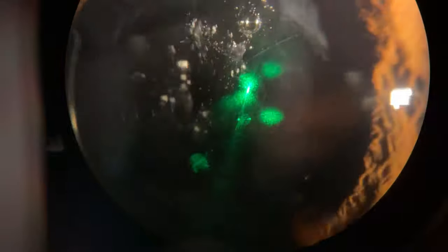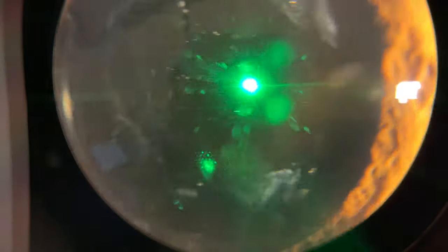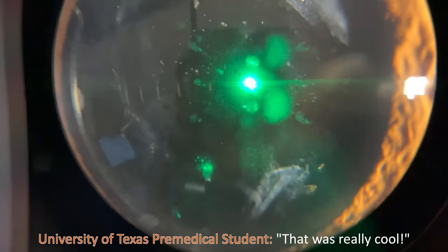And then I open that layer. Now he's looking through a clear layer, no longer the cloudy layer. You get it? That was really cool.